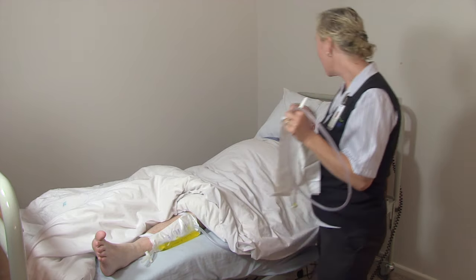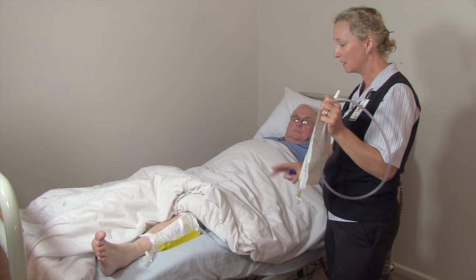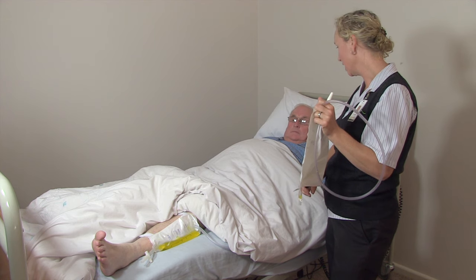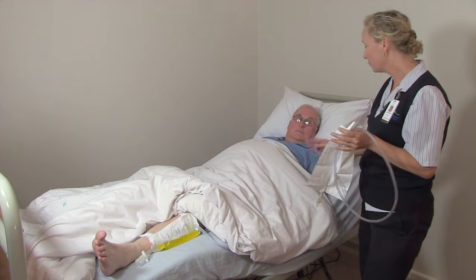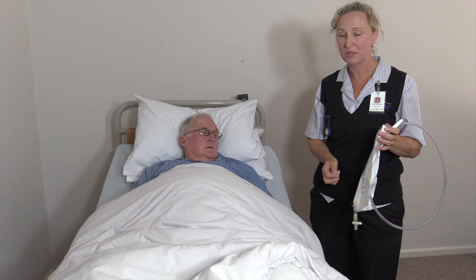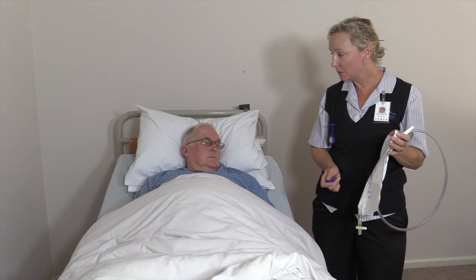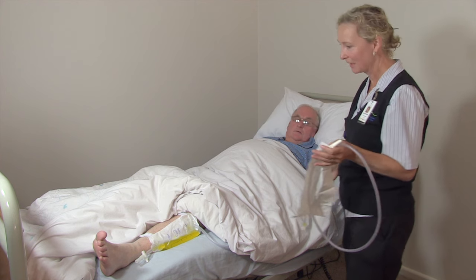With the day bag, it can also be used for a week but it can be left on until your nurse comes and changes it. With the day bag, you can move around as freely as you like, and then overnight you've got this one. So it's really simple. Do you think you can manage that? Yes, that's very good.